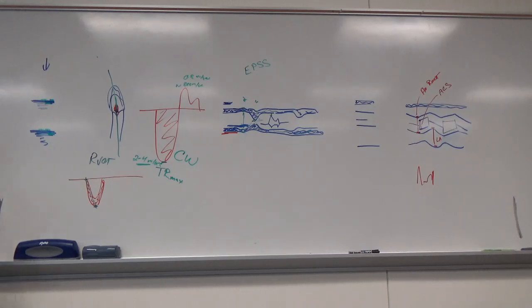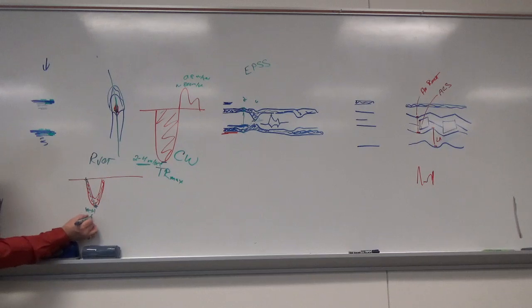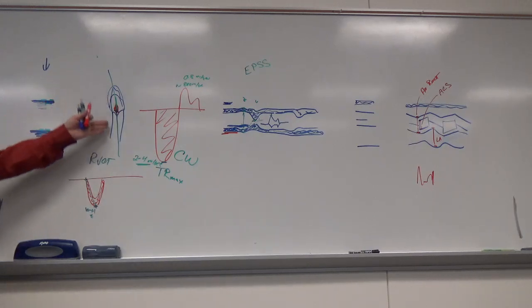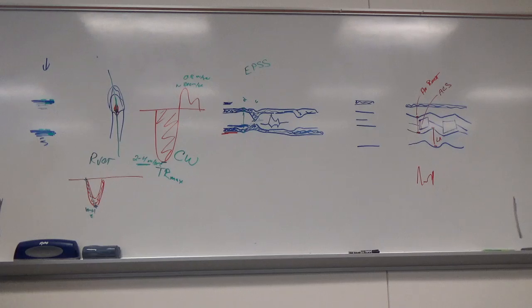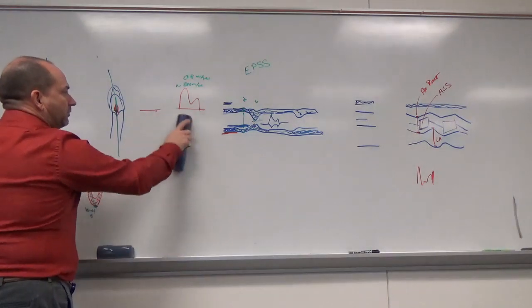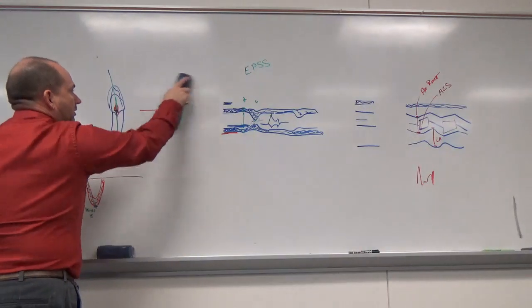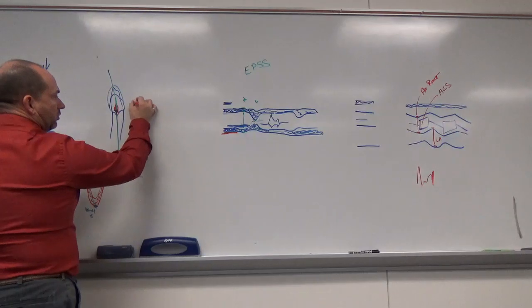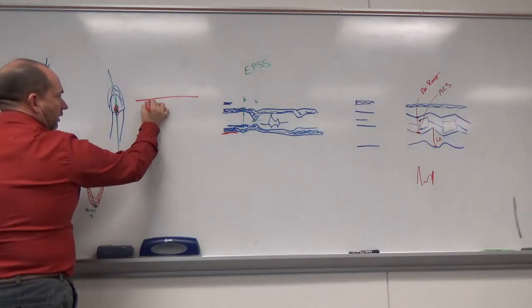So what we're actually interested in here is the time that occurs. Okay, so that's acceleration time. This is actually in the RVOT. And then the next one we do is we throw a continuous wave through here. And now we're going to see the maximum flow through that area. So let me erase all this. Now it just came from 2 to 4 meters per second.